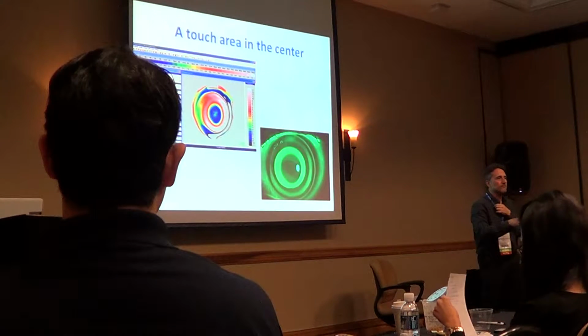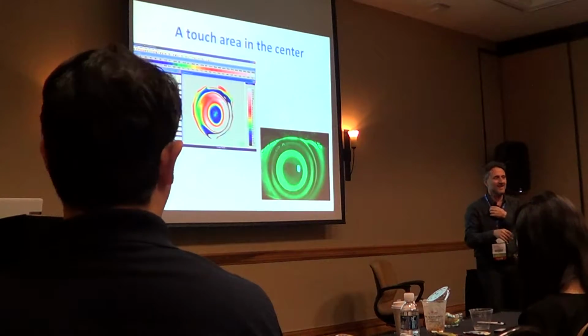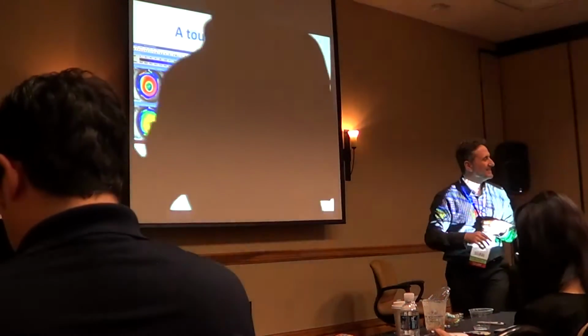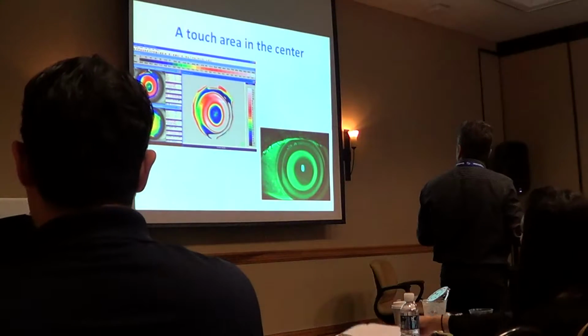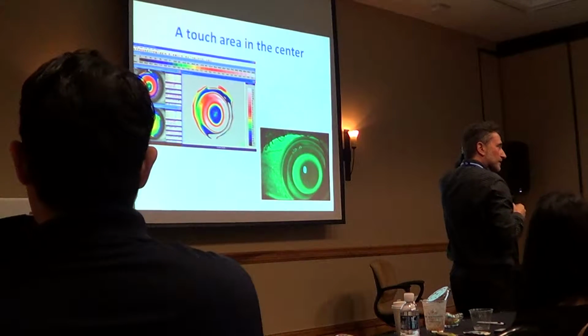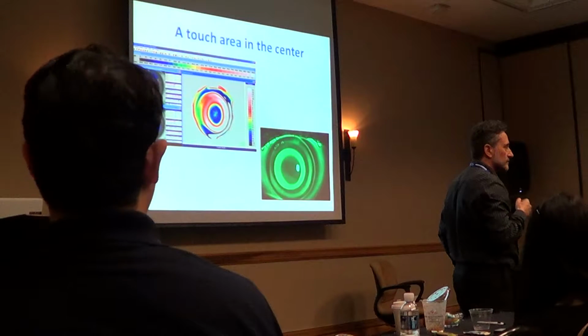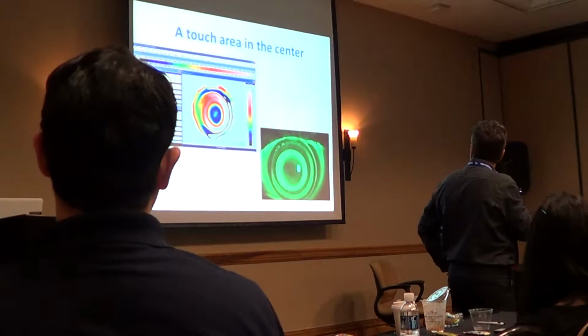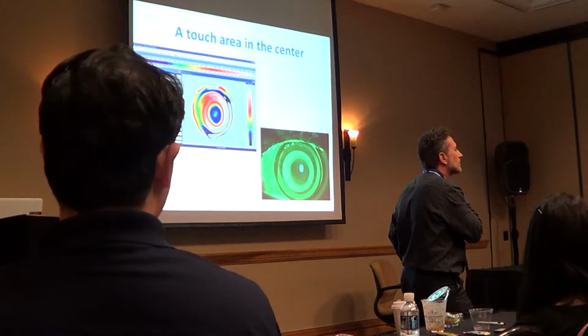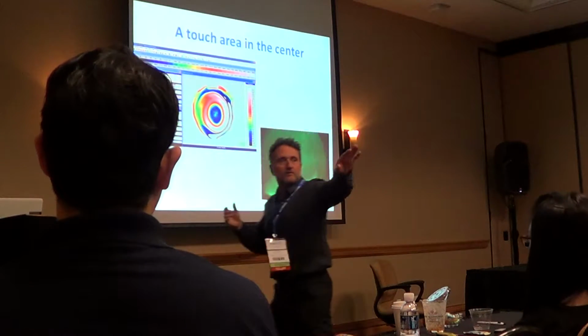Okay, that's right? Well, it looks like the treatment zone is pretty well centered. Oh, yes. But we have an under correction zone. Okay, but I'm seeing if the treatment zone is centered, then the lens is actually centering, it's just tilting. Yeah. I'm going for your question, okay?